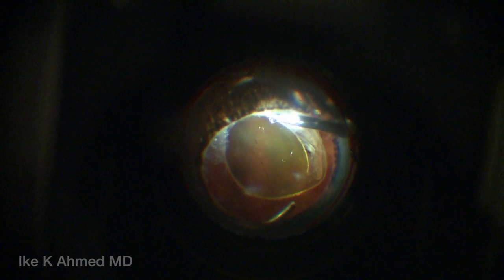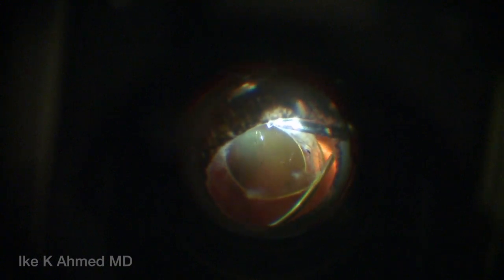We're going to place the peripheral retinal viewing system on our scope and proceed with visualization behind the IOL. It really helps to have that chandelier lighting system in place to free up our alternate hand to hold the IOL capsular bag complex. Some of the best places to hold the IOL are at the haptic, the optic, or the capsulorhexis edge, as seen in this case. The vitrectomy is performed with minimal movement, ensuring that the vitreous is cut and aspirated around the IOL in a very controlled fashion. The previously injected kenalog is helpful to visualize the stained vitreous, and you can see where it has gone posteriorly. We're now superior to the capsular bag complex, slowly and carefully removing the vitreous in this area.